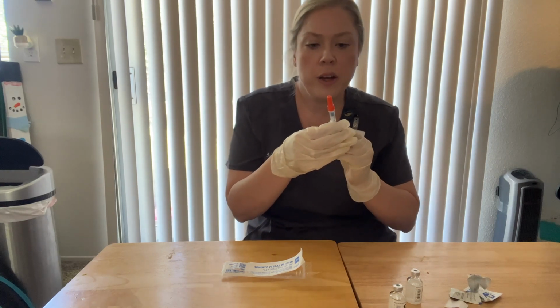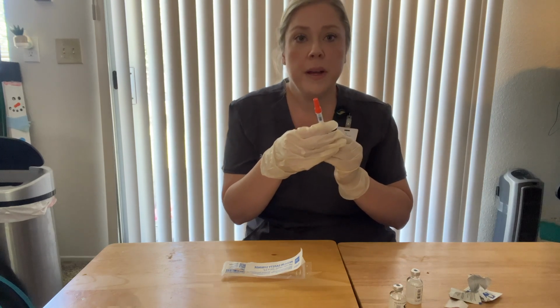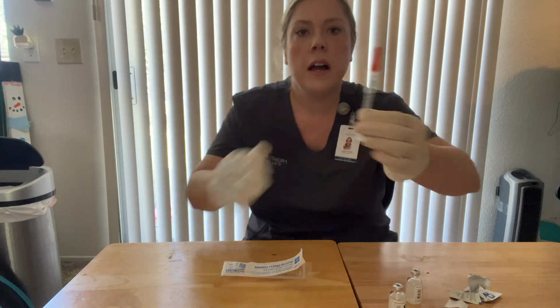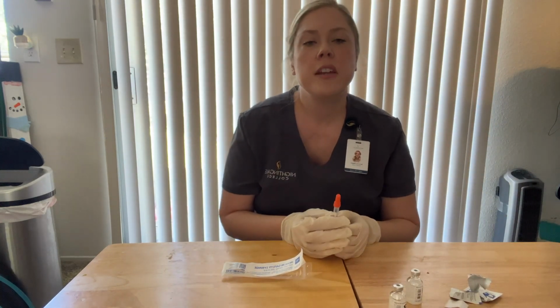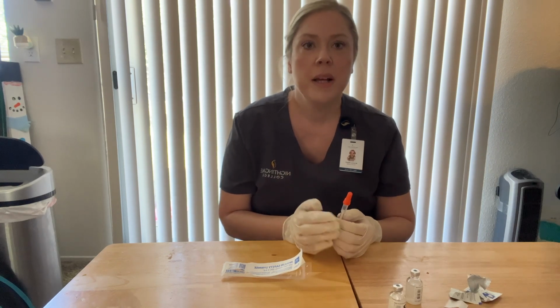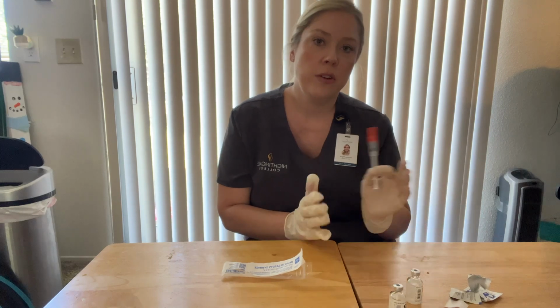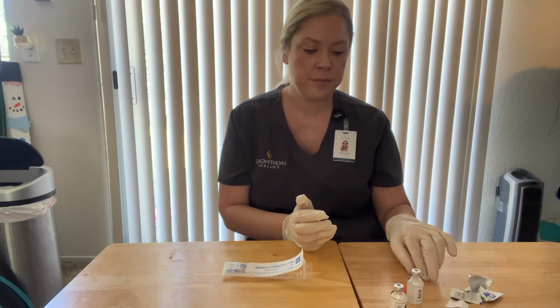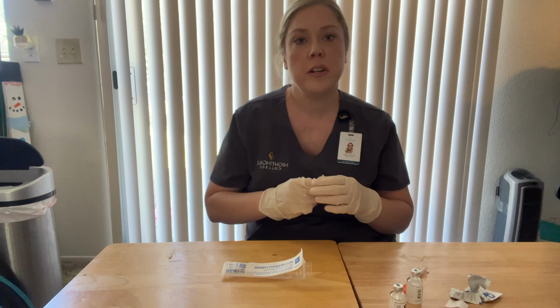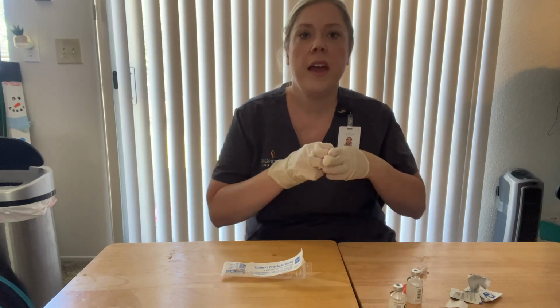And then I'd want to go ahead and check that MAR one last time, making sure that, again, the 12 units is correct. I need to show you the 12 units. Okay. If we prepared the medication away from the patient, we would want to safely recap the syringe, label the syringe with the medication and the dosage, and then we would bring it over to our patient. After administration, I just want to remove my gloves, perform hand hygiene, and then document.